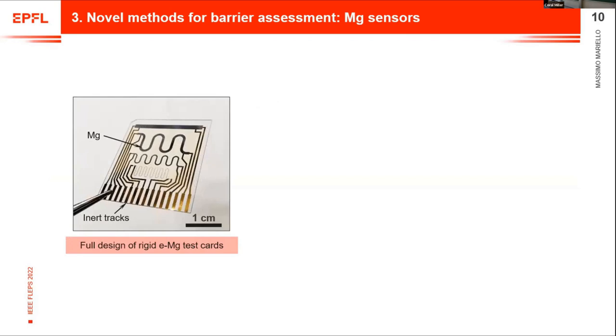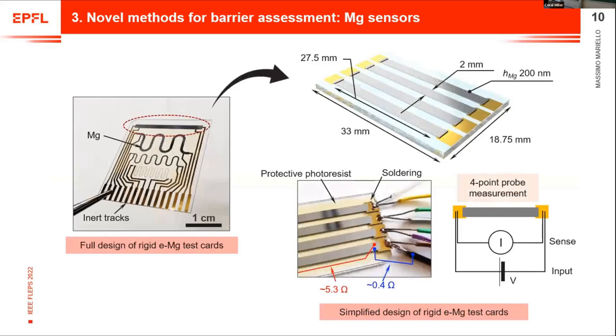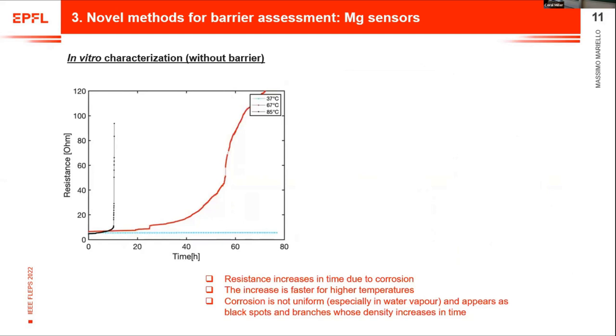Let's start with the first one. These sensors, which we call magnesium test cards, are based on thermally evaporated magnesium patterns on a glass substrate with inert gold interconnections. Here you can see a simplified design. The ends of the interconnections of each magnesium stripe are soldered with a couple of wires in order to perform four-point probe measurements and have accurate real-time monitoring of resistance.